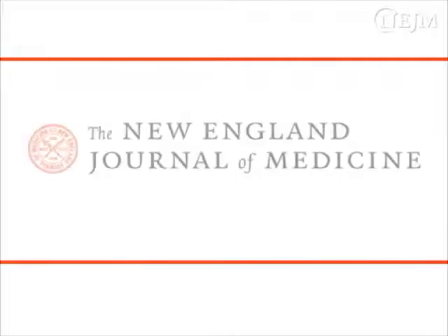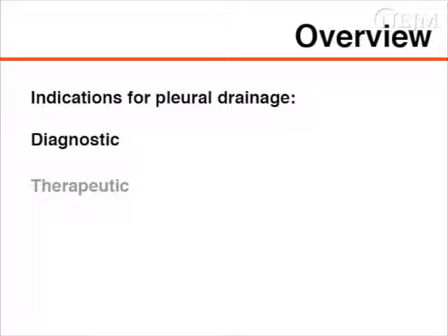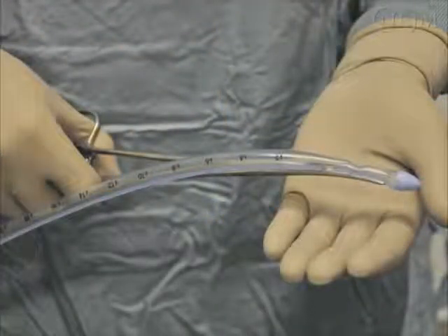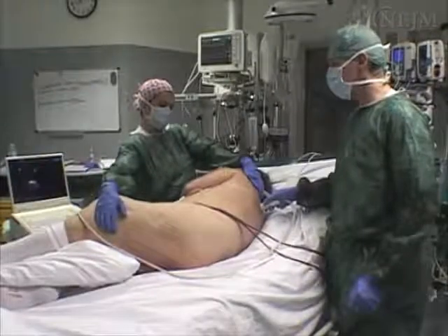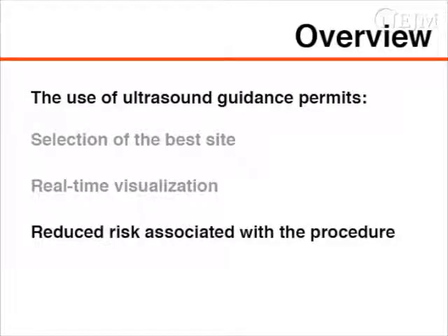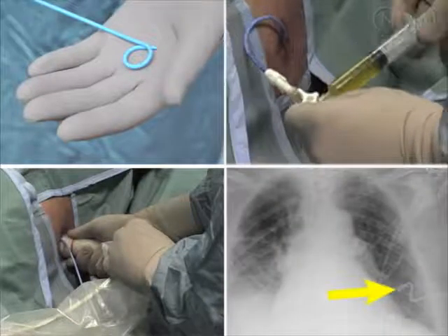This is a video in clinical medicine from the New England Journal of Medicine. Drainage can be performed at the bedside with a single thoracentesis or, for continuous drainage, with the insertion of an intercostal drain. The use of ultrasound guidance permits the selection of the best site for access to the pleural effusion, step-by-step real-time visualization of the lung structures, the advancing needle, and reduced risk associated with the procedure. This video demonstrates ultrasound-guided placement of a small-bore pigtail catheter for drainage of a pleural effusion.